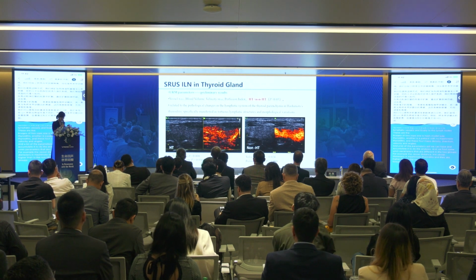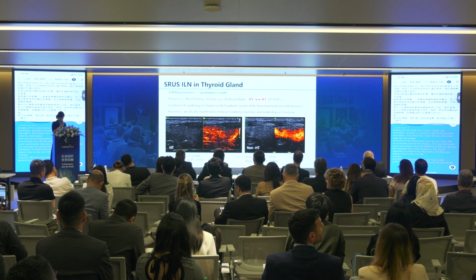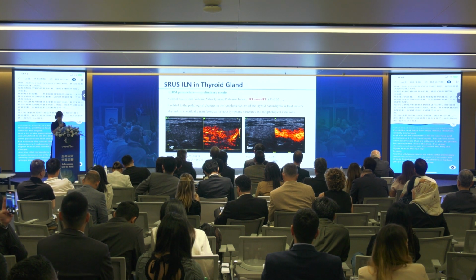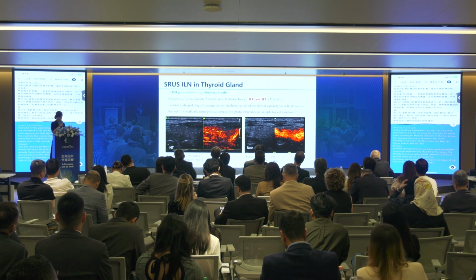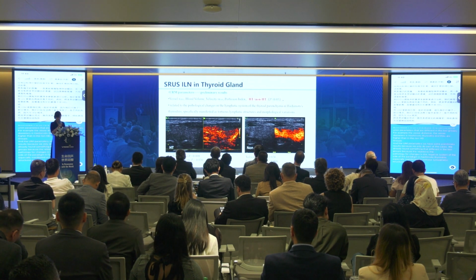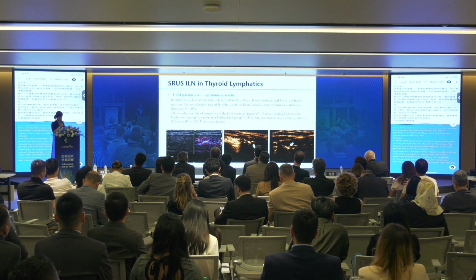And for the URM parameters, we have some preliminary results because we have only done part of the cases. We already found something different in the two groups, related to the pathological changes in the lymphatic system of the thyroid parenchyma in Hashimoto thyroiditis, especially manifested as tortuous lymphatic structures and morphological variations. And parameters such as the vessel ratio, density, blood volume, and perfusion index increased.